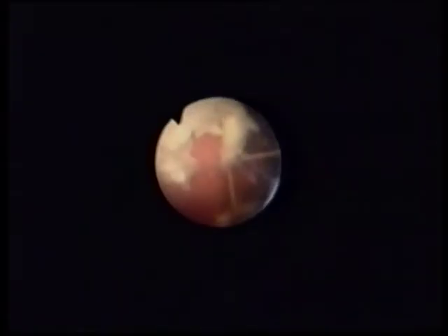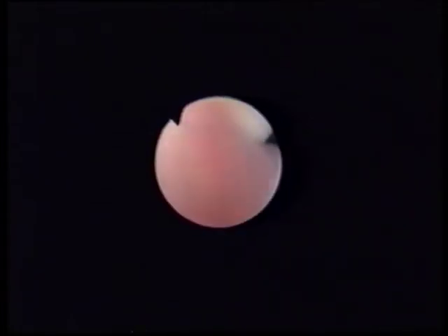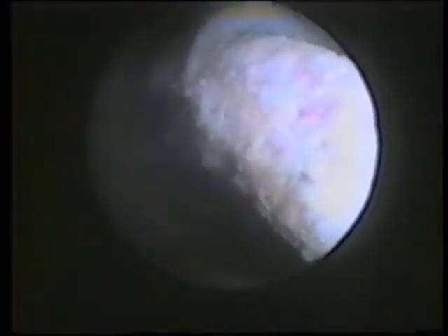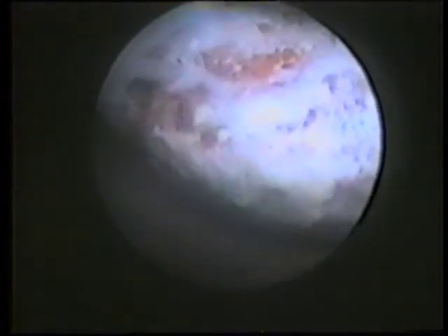The stones consist of struvite and hydroxyapatite crystals, which can be quite soft and friable. Any attempt to remove stone fragments with grabbing forceps merely breaks them into smaller fragments, whilst the time-honoured Dormia wire basket remains a slow but safe way of extracting them. If left, small stones grow into large ones, demanding more aggressive intervention. If a catheter is repeatedly blocking, a cystoscopy should be performed to check for stones.